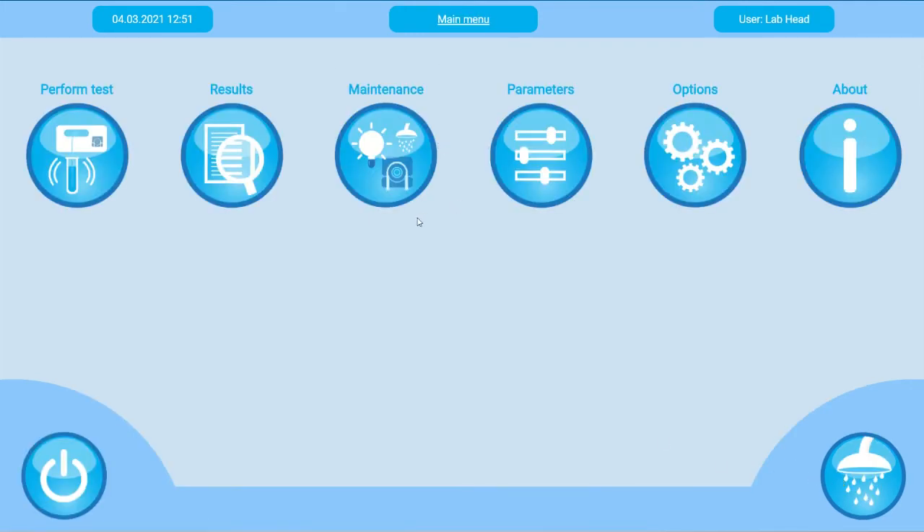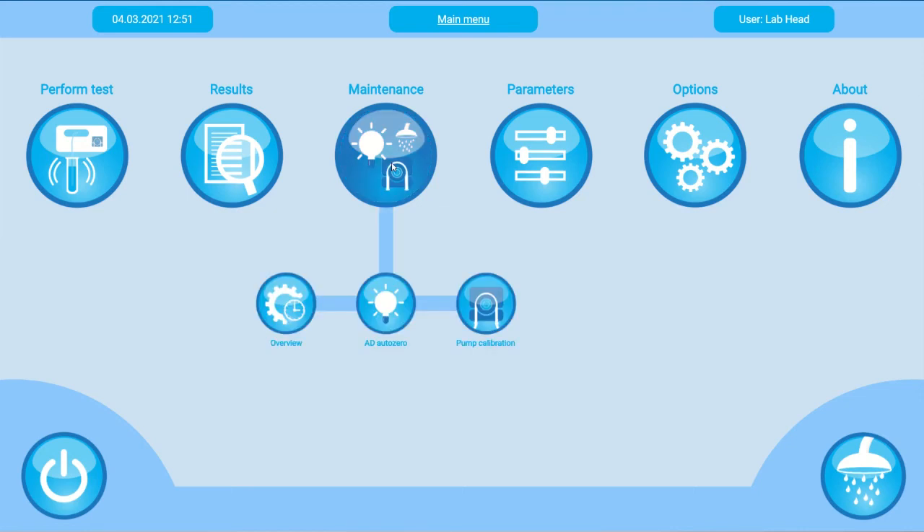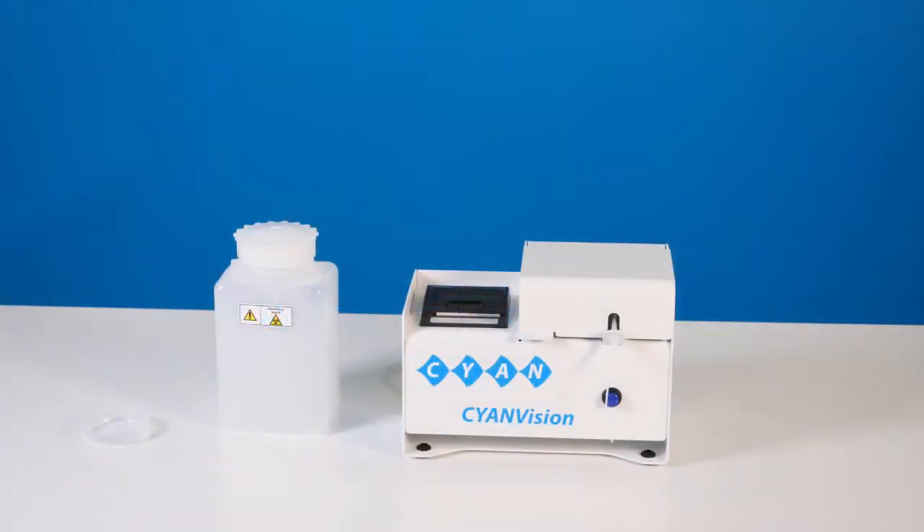Now you will use the hydraulic system for the first time — watch out for possible leaks. You must perform three steps: washing of the hydraulic system, pump calibration to verify the aspiration, and AutoZero of the optical system. We have a dedicated video for all three steps. Now you are ready to go. If you like, you can customize and personalize the system to your needs — we made a special video on that.